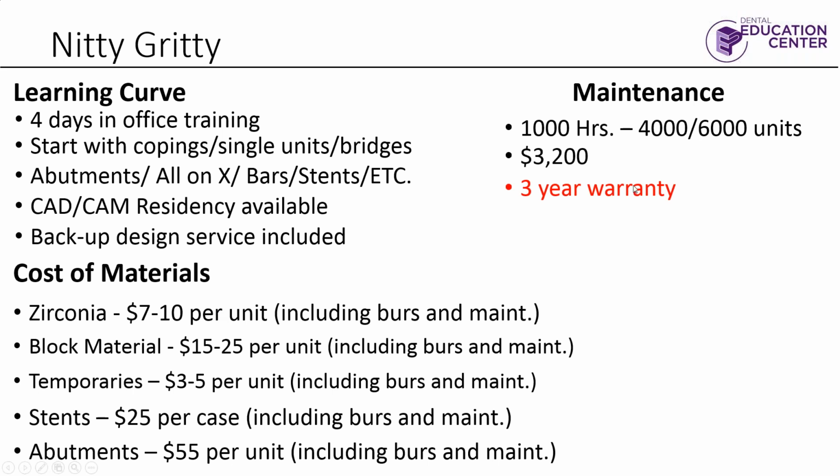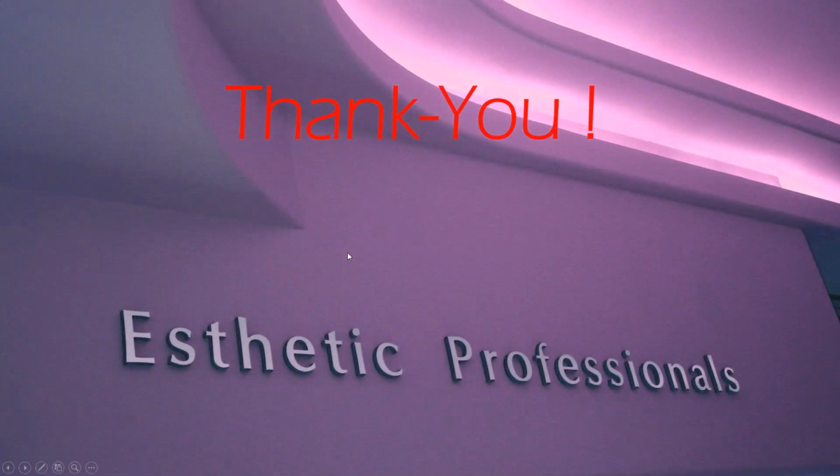There is maintenance involved, so we recommend 1,000-hour maintenance on most of this equipment, which runs about $3,000. 1,000 hours of milling is a long time, and I'm sure Dr. Shank can attest to that before you actually have to start doing maintenance on it. I'm sorry I went over. That definitely does take a while to get there. Yeah, to get to the 1,000 hours.